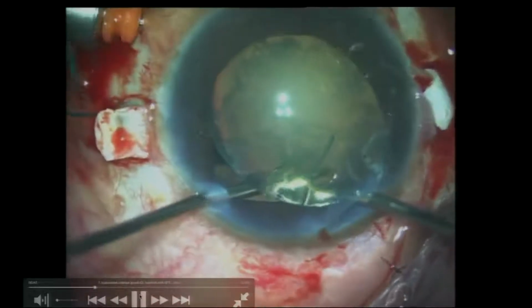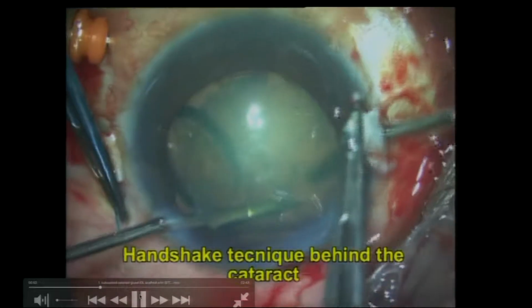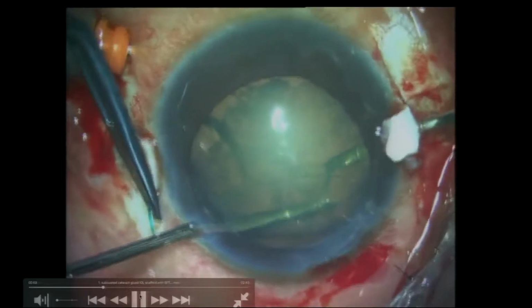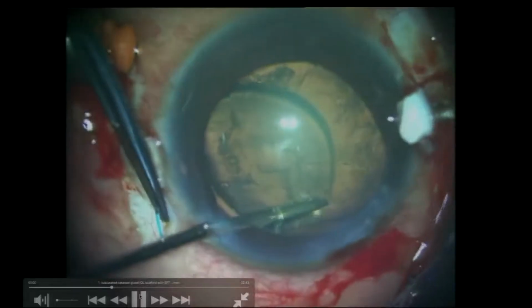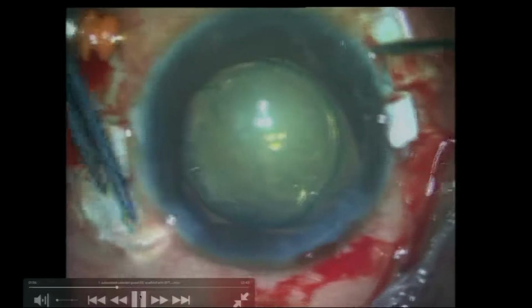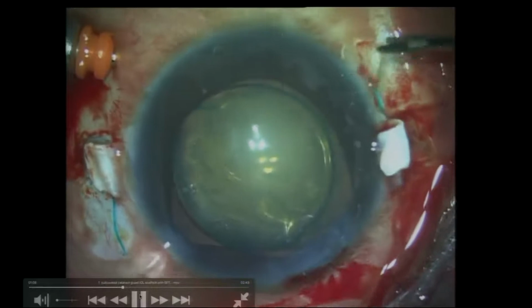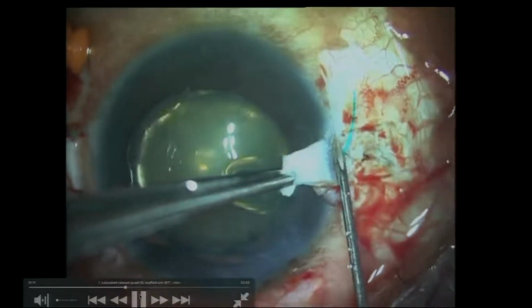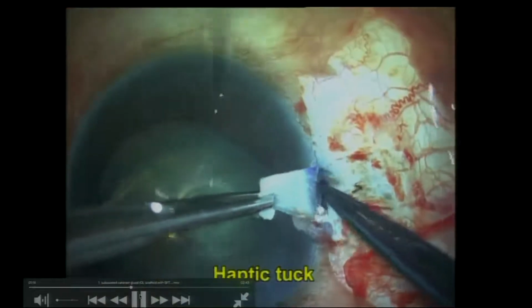And you can see with the red glow itself, you can actually visualize the haptic tip. Once you're visualizing the haptic tip, you can use a bimanual approach, a handshake technique of its own, and actually externalize both the haptics. This way, you've basically created your own posterior capsule. You've made a posterior capsule that will prevent any cataractous lens from dropping once you are doing a phacoemulsification. So this is one method that I've employed.